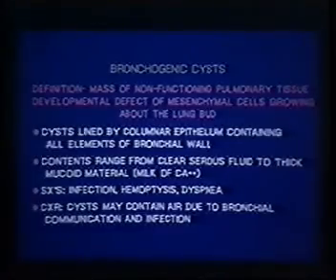That's particularly obvious, of course, to the pathologist, not so much to the radiologist, in differentiating these cysts from cysts that occur in other organs and sites. The contents are very variable, and that's important in terms of our ability to recognize them roentgenographically. They range from very clear fluid to thick, very mucoid material, and as I'll show you, these can even be calcified. They're not asymptomatic all the time. They can be an incidental finding, but they can cause infection and they can bleed, and as I'll show you, they can be a cause of dyspnea. And because they can have bronchial communication, they can get infected, and so we can see them as containing air on a chest radiograph.